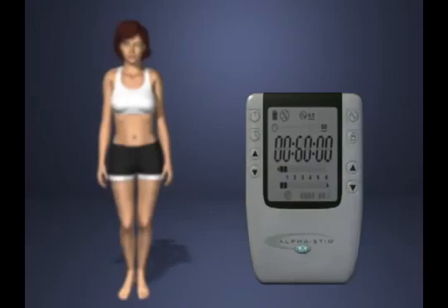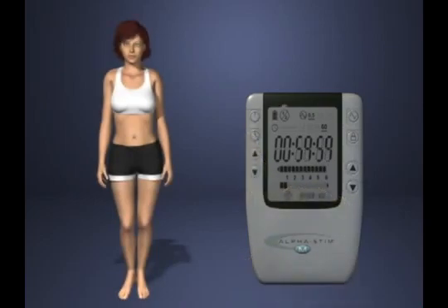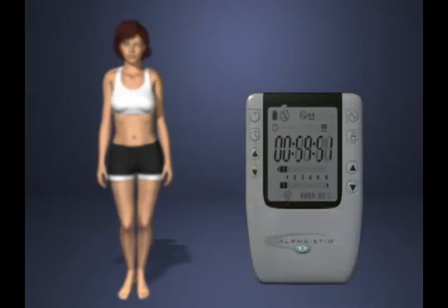20 minutes to 1 hour per Astrode electrode location is the usual treatment time. Set current on the channels in use to desired setting. Use 600 microamperes for maximum pain relief. Decrease immediately if it is uncomfortable. Use 100 microamperes when using electrodes for over 1 hour.